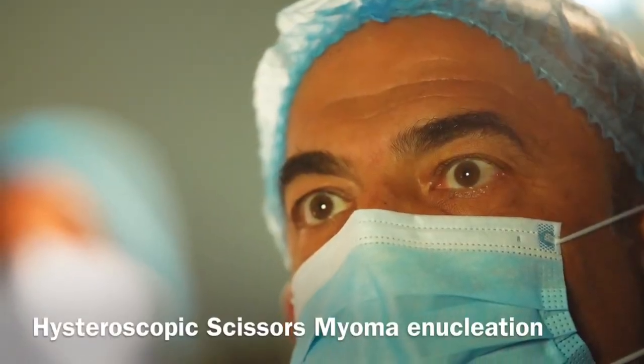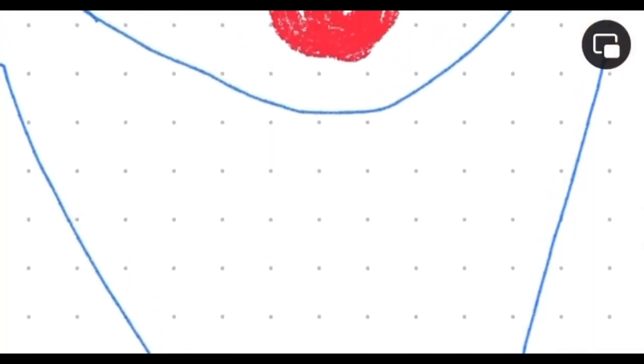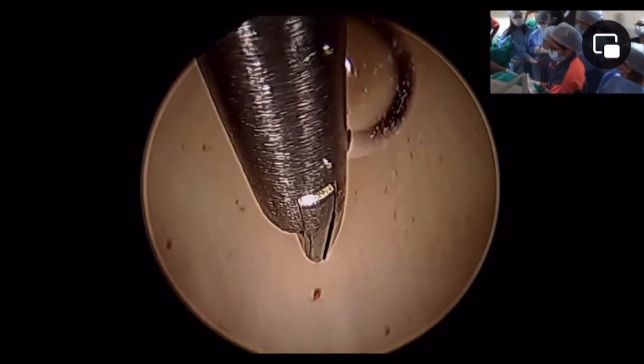And now, together, we will expand the scope of hysteroscopy to manage unusual situations like this type 3 to type 4 fundal submucous fibroid. Well, everybody agrees that hysteroscopy was chosen as the approach for myomata or pathology bulging into the cavity. What about pathology in the myometrium?